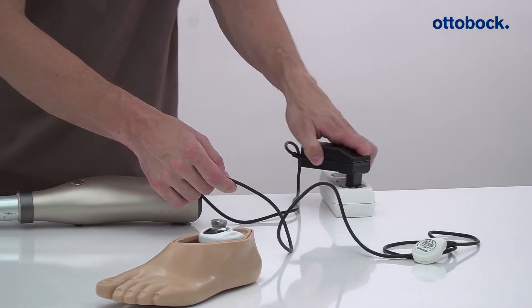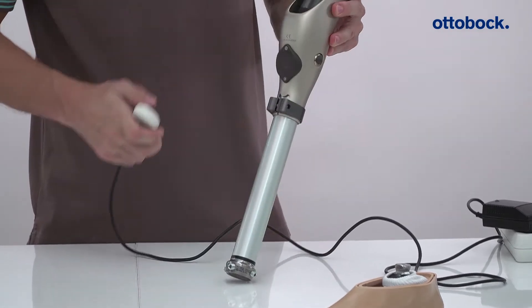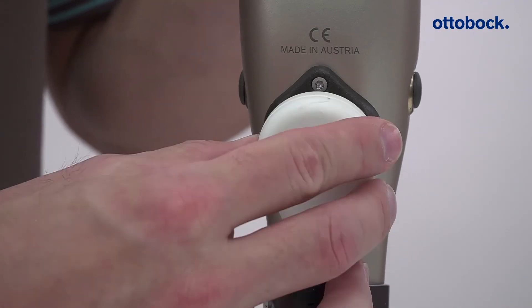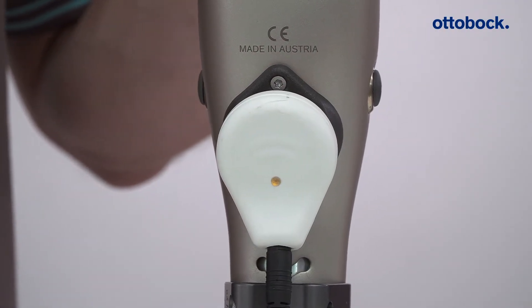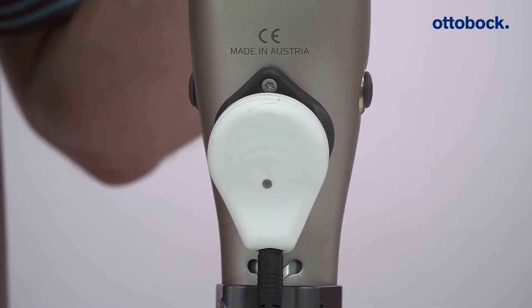Now carry out a functional test by switching on the joint with the help of the battery charger. If the diode on the power supply unit lights up green continuously, the joint is fully charged. If the diode lights up yellow as shown here, the joint is being charged.